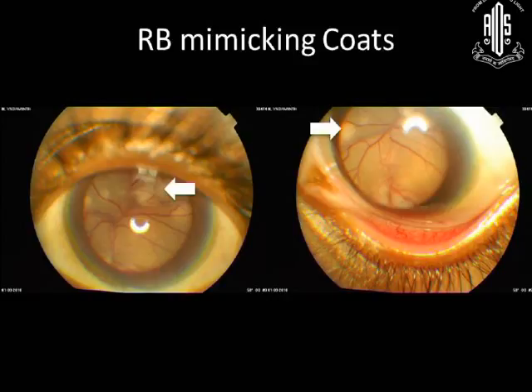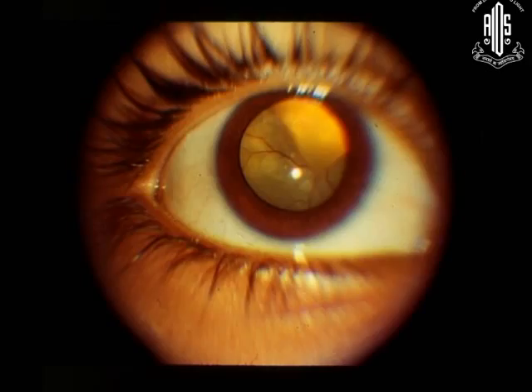So look for a mass lesion under the retina. So this will be an exophytic retinoblastoma. That is the reason you've got an exudative retinal detachment. So look carefully for involvement of the retina. This white stuff is the lesion which is involving the retina, full thickness retina. That will be a clue to make out that this is retinoblastoma indeed and not Coats disease.